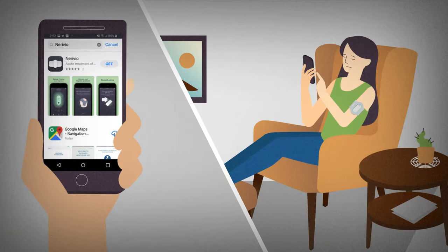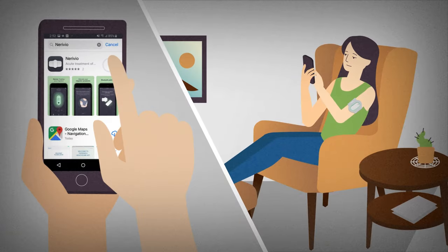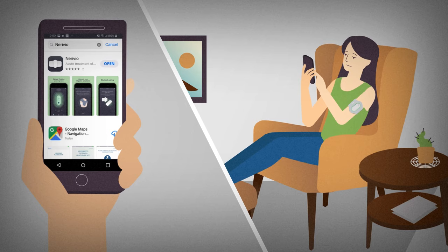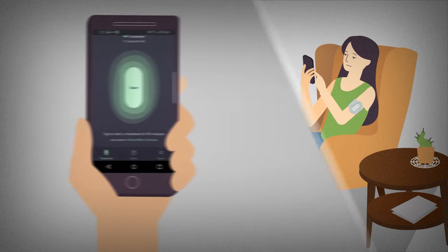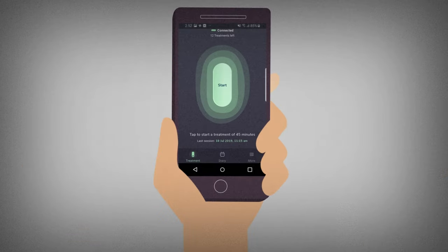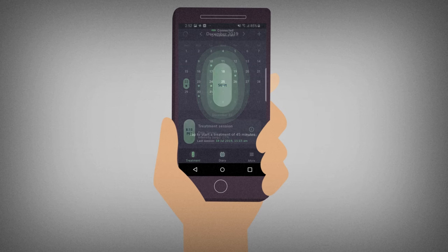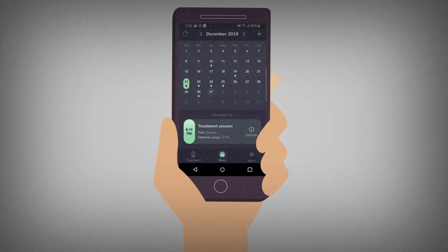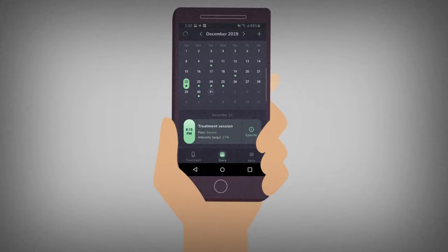The device is controlled by an app that you should download and install on your smartphone. The app enables you to control the Narivio device and provides access to information about your migraine headaches and your treatment sessions.